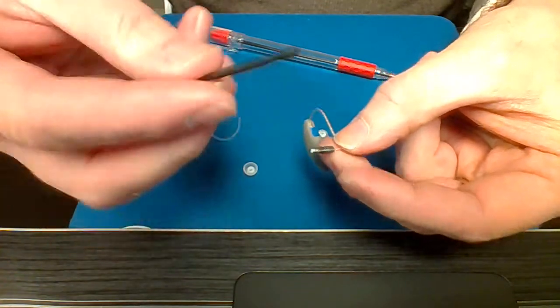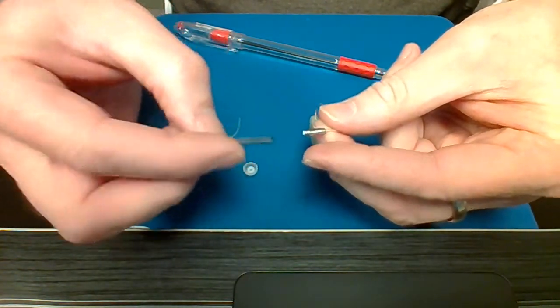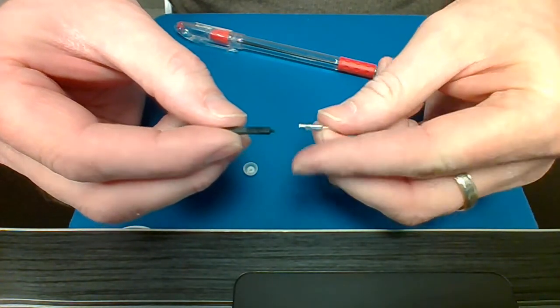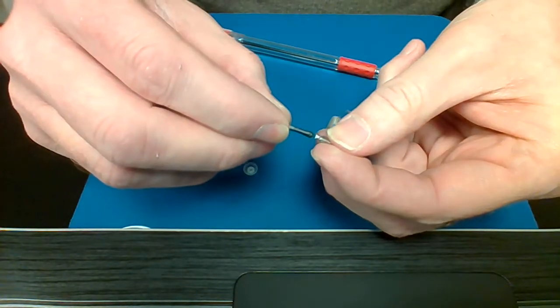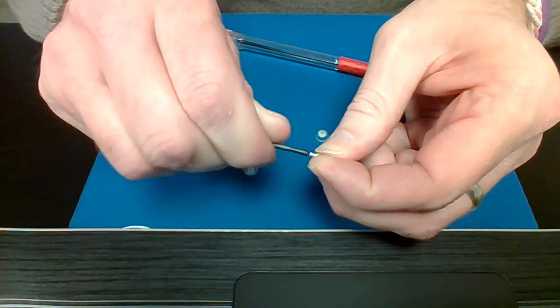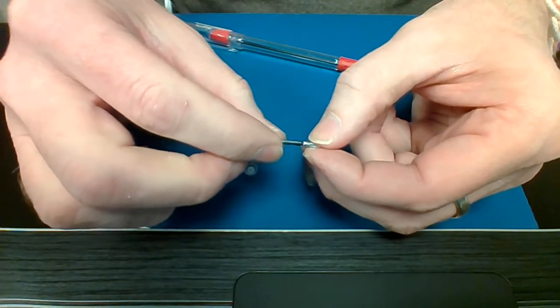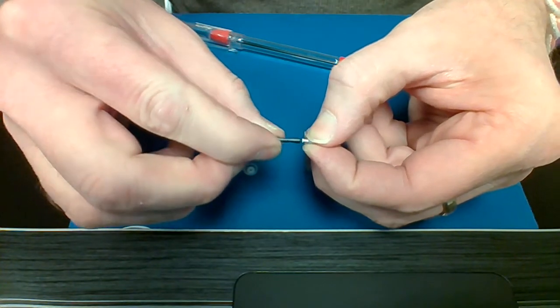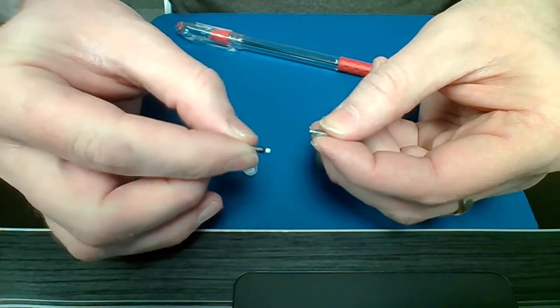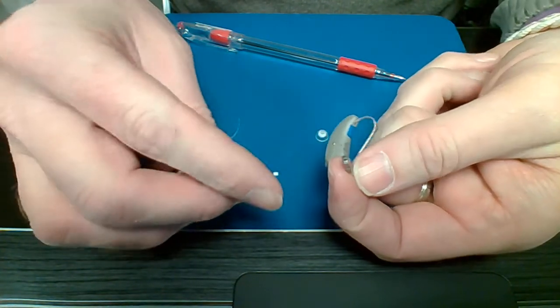We're going to take the new wax filter stick, and it has a threaded end. I don't know if you can see that, but it is threaded, and you just take that, put it inside that filter in the end of the receiver, give it a twist. You don't have to sink it all the way in, just give it enough to get a good bite, and then you pull, and the old filter comes out. See, just like that. Now you don't have a filter in there.